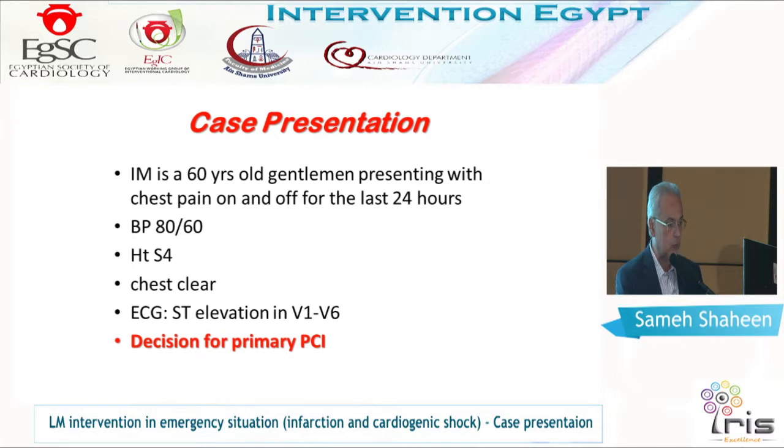لكن أنا عايز برضو أطمنكم إن this is not the usual practice. إن إحنا نشوف حالات يمكن يكون it's not a straightforward case. عشان اللي بيشتغلوا من الشباب الصغير اللي بيشتغل primary PCI, we want to promote this technique. Primary PCI is usually straightforward and simple in most of the cases. Maybe in 10% of cases you might find some deviation from the usual form.